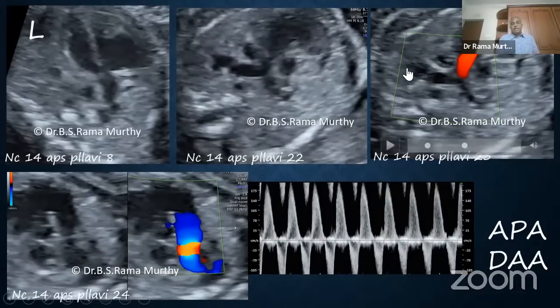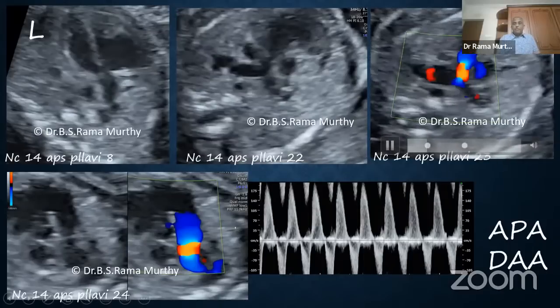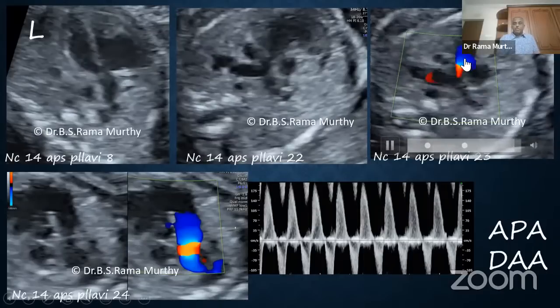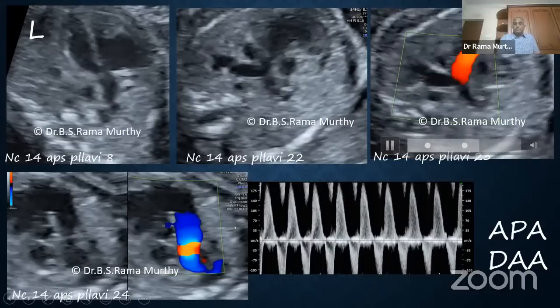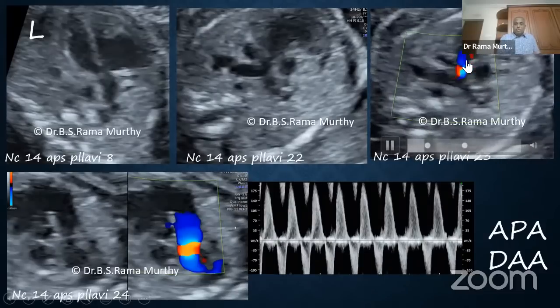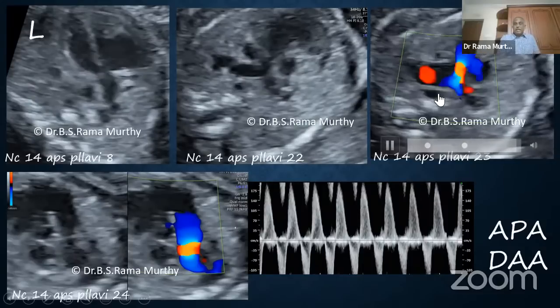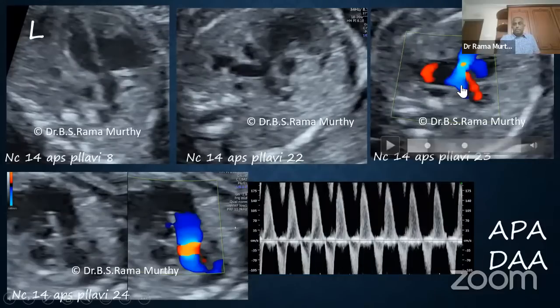So let me stop this clip, and then you start the Doppler. When you put the color Doppler, when you bring your color box in, you will find that the flow is blue during systole. And when it is blue, you get a lot of aliasing which is happening there. So let me take you there. That is the blue, which is a normal flow direction from anterior to posterior, but there is aliasing telling you that this is a stenotic valve, the pulmonary valve, right?